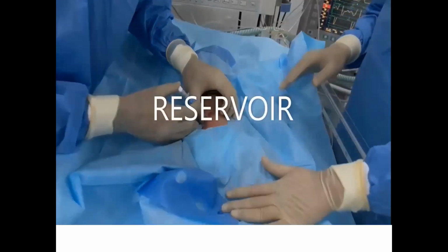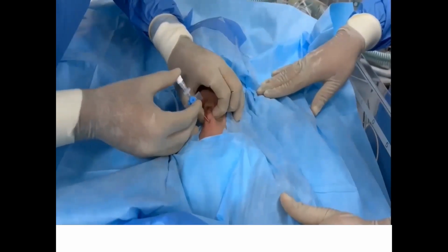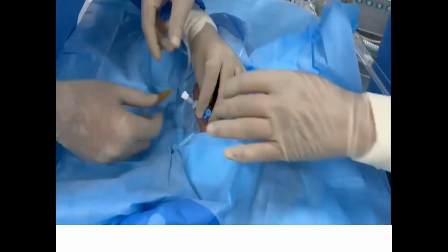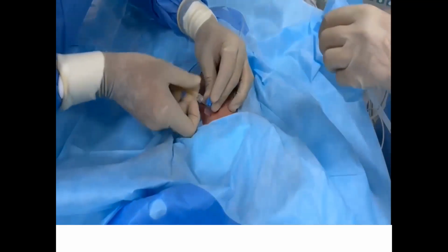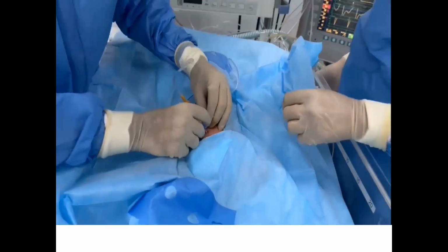After infiltrating the skin with local anesthesia, we have to create a fluid filled reservoir in the peritoneal cavity using a 22 gauge cannula. We have to insert the 22 gauge cannula just below the umbilicus in the midline, and then we have to instill 20 to 30 ml per kg of dialysate into the peritoneal cavity.